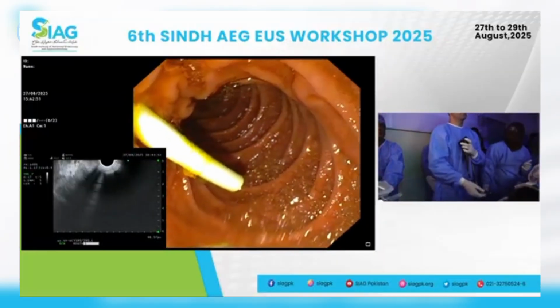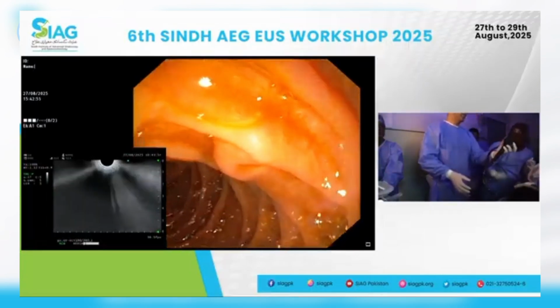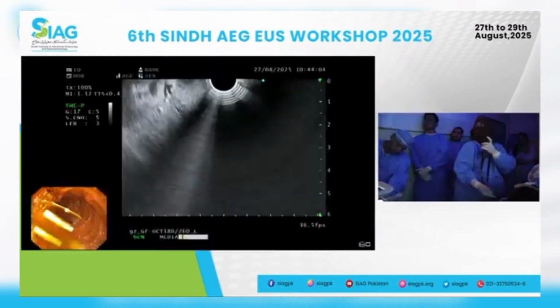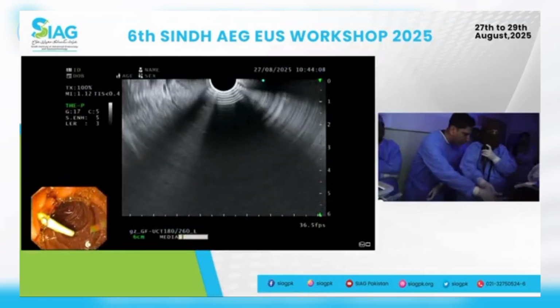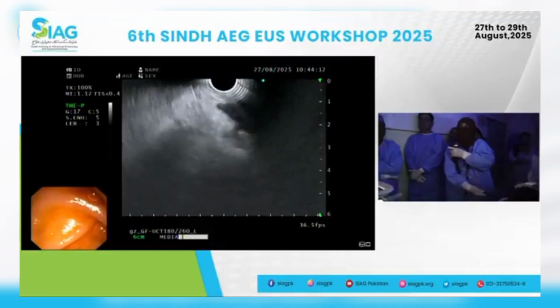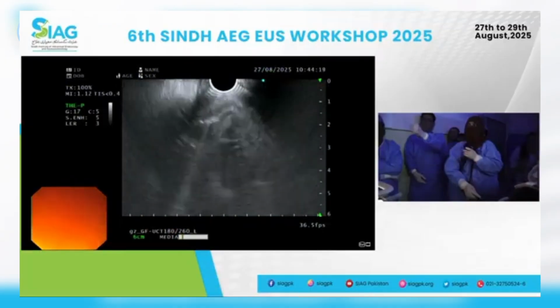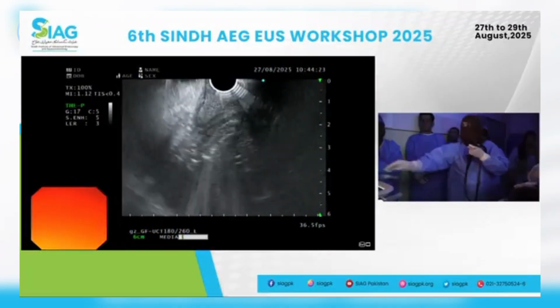Okay, we've gone further than what we intended to, but what we can do is just do D2 examination. So let me give the scope back to you. Suction as much air as possible. Please enlarge the EUS image. Shorten, did you? Yes, I did. Have a look at how much scope we have. You can do a bit more, yeah, bit more. Good, excellent. That's fine. So you've just had a view of the right kidney there. But I think it has fallen back.